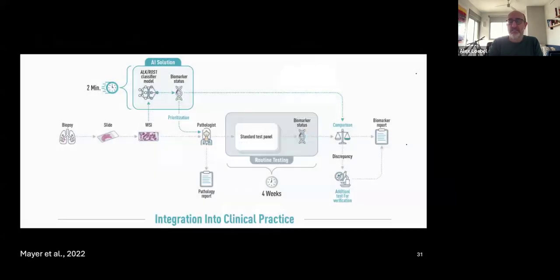Good. And so then the last thing that I wanted to mention is that, okay, so I was talking about all these AI models and diagnostic and prognostic and foundation models, and they are very good in doing subtyping, in predicting the genetic mutations from the H&E and so on. But how do you work with that? Because none of those models have gone for FDA approval yet. So at Sheba, what we do is the following.